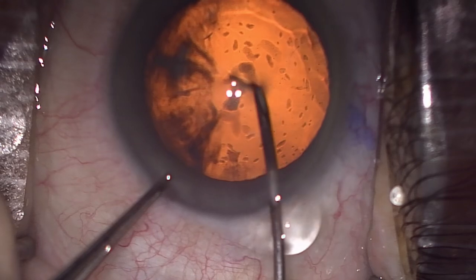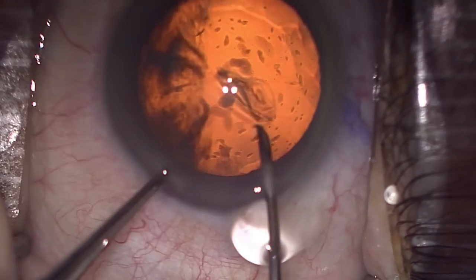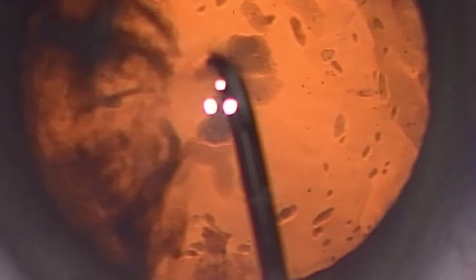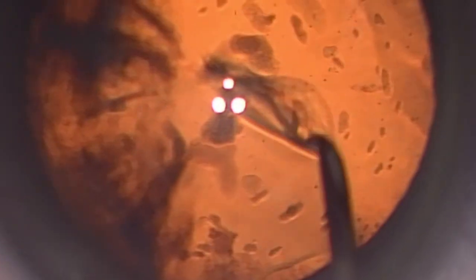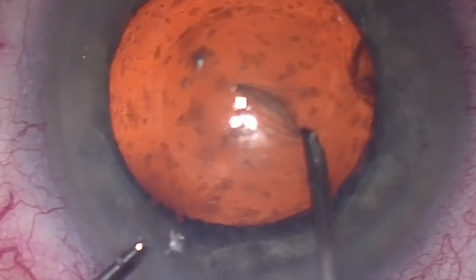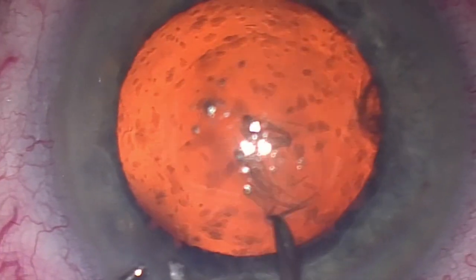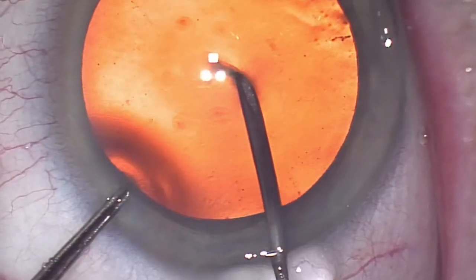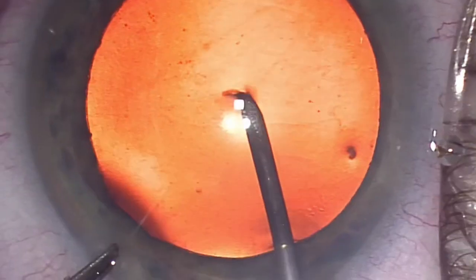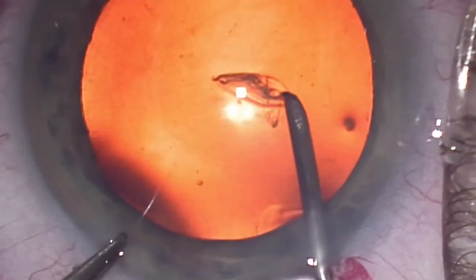I've started getting frustrated with one part of the capsulorexis, specifically this part here where you start. I didn't always consistently get the leaflet to fold over, and sometimes required multiple passes — two, three, four passes — to flick the leaflet over. Just pay attention to the movements of the cystitome tip and how we have to work to reflect that anterior capsule leaflet over.